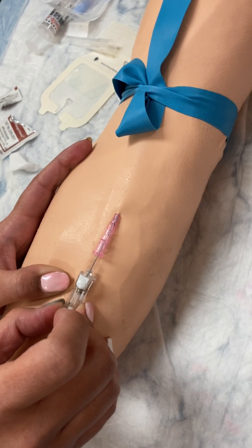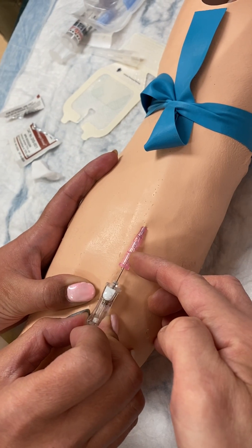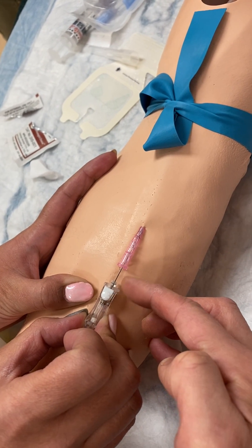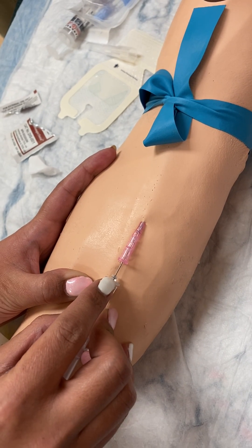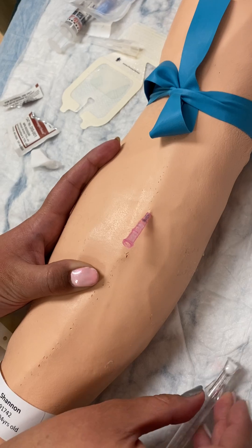You can see that she advanced the pink catheter off of the needle, so the needle isn't going to go into the vein anymore. Now she's going to push the button and that will pull the needle out.